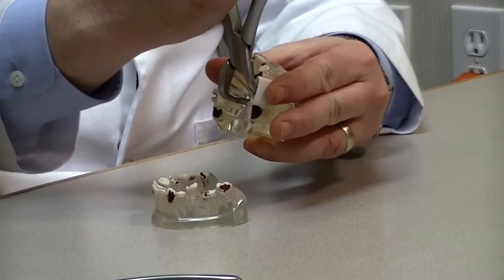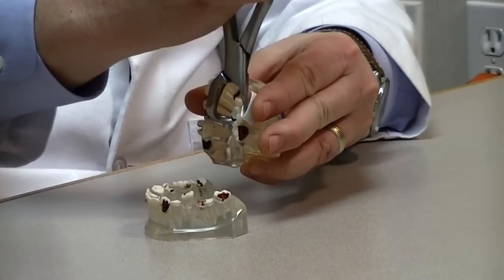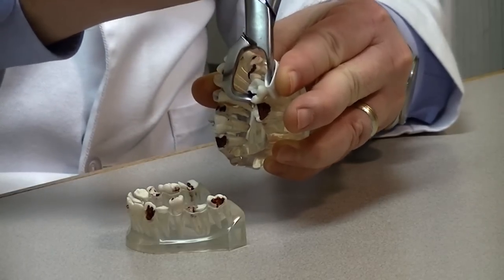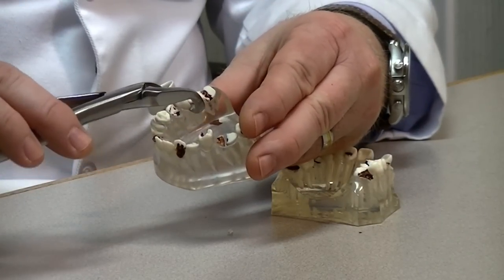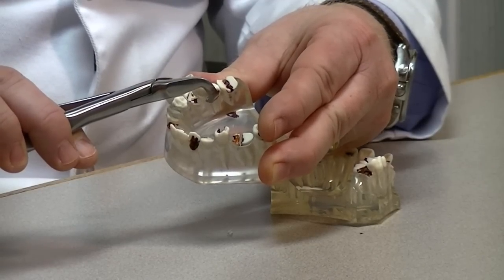The GMX 400 series is a two-instrument series that's similar to the standard Golden Physics forceps instruments, but it's a little bit different. You can still engage the palatal surface of a maxillary tooth, putting the bumper in the vestibule and rotating your wrist, but a little bit differently than the standard series. It's more like turning a doorknob and simply luxating the tooth out of position. It can be used contralaterally if we go to the mandibular aspect and engage the lingual surface again and simply luxate the tooth out of position.